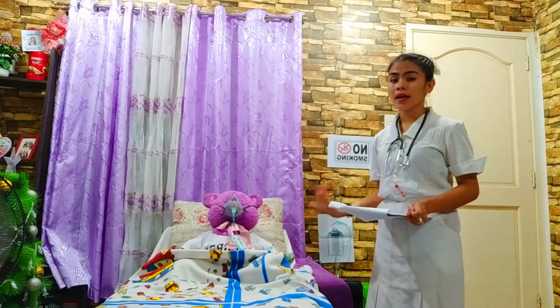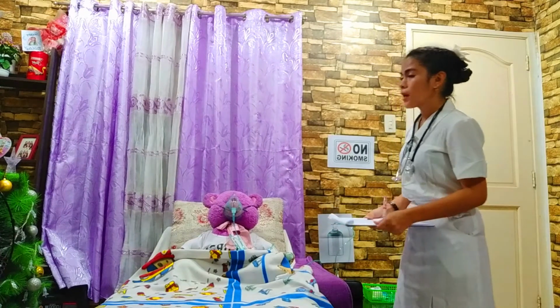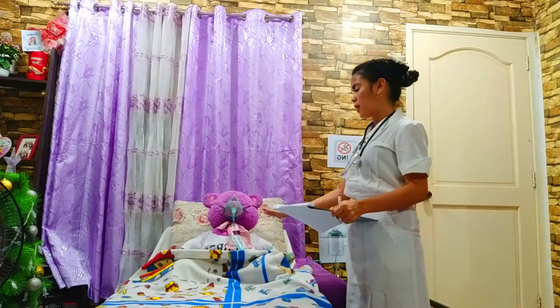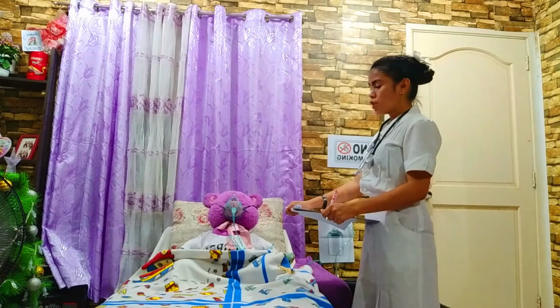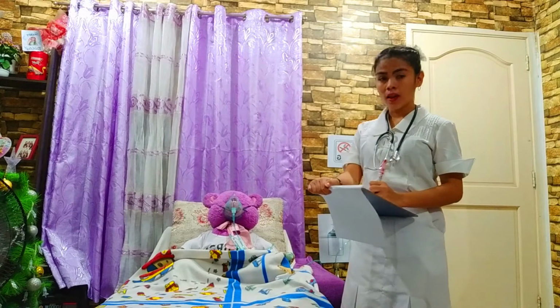As you can see and as you could hear a while ago, I asked her if she was comfortable during the administration of the oxygen through the oxygen mask, and she answered yes naman. She is comfortable. And that's all for this return demonstration.